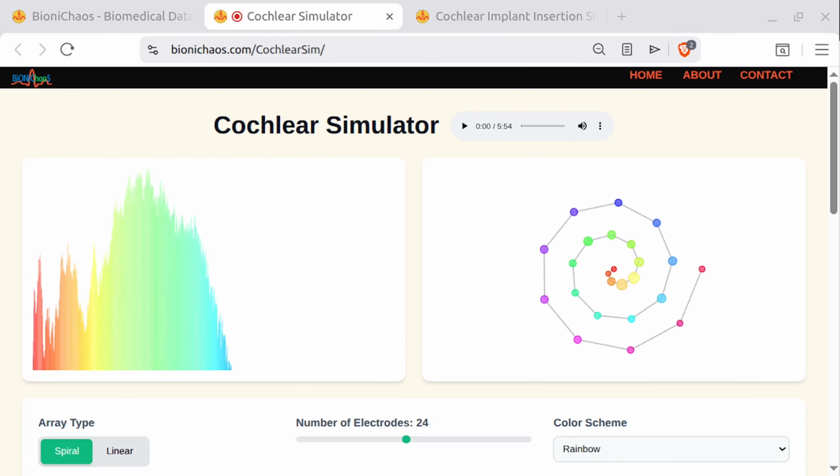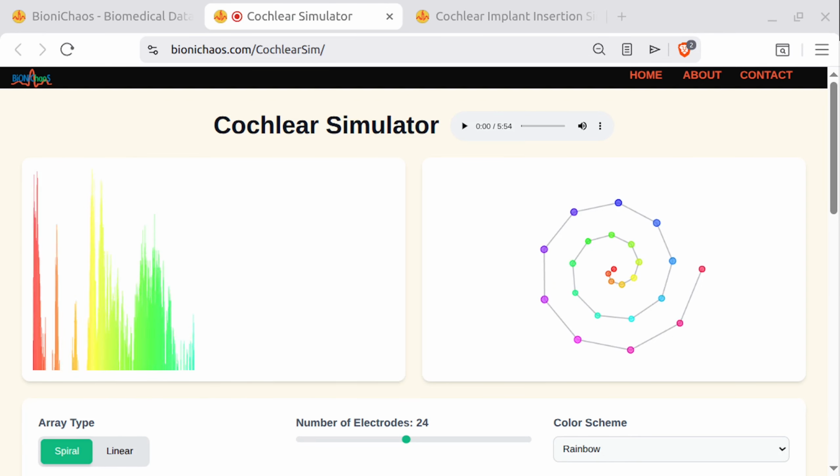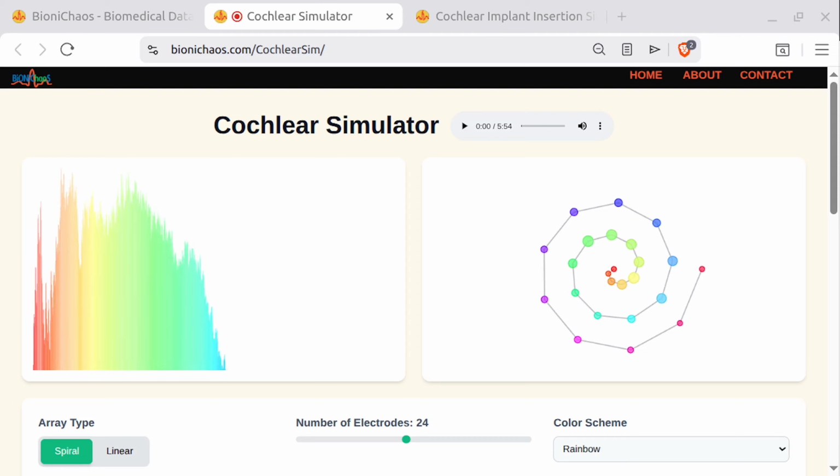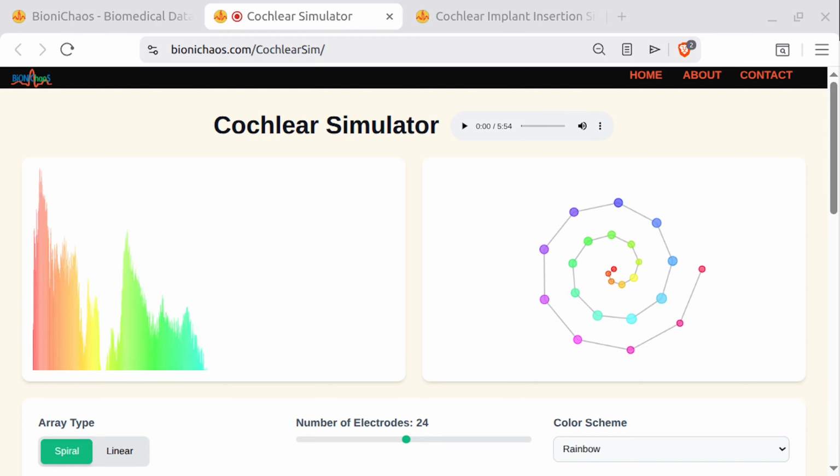That is the absolute best case scenario, though. But look at the darker reality of the data that magically doesn't make it into the surgical consultation brochures. It's all in the literature. Yes, some patients see their tinnitus drop, but 20% of patients report the sudden emergence of entirely new tinnitus immediately following the surgery. Well, 20% is... Imagine undergoing an invasive skull surgery to fix your hearing and coming out with a constant, inescapable siren in your ear that you literally never had before. It is a known risk. Furthermore, nearly half of all patients experience a temporary, sometimes violent, aggravation of the ringing they already had. But it usually stabilizes. Usually isn't a comfort when you're the one lying awake at night for 6 months.